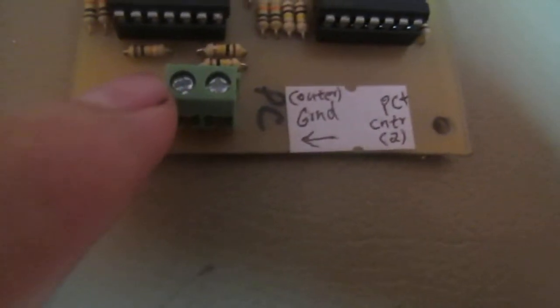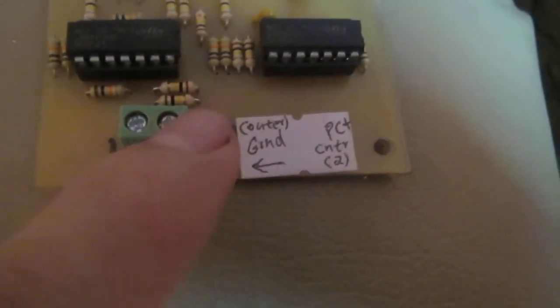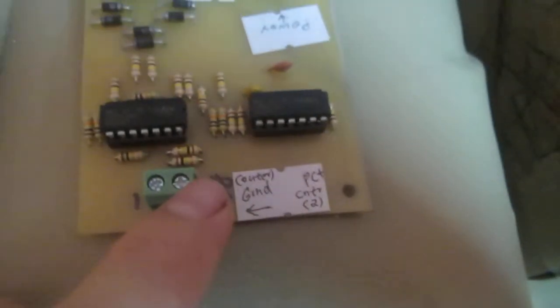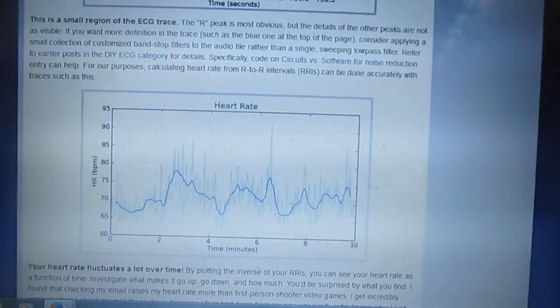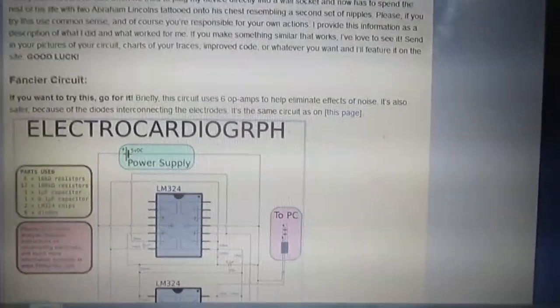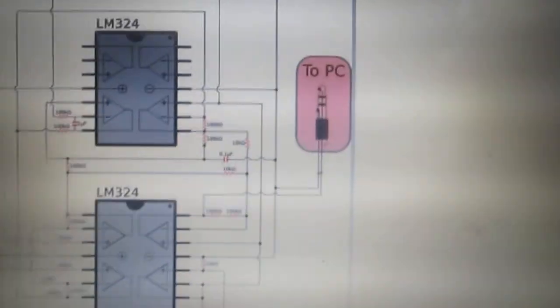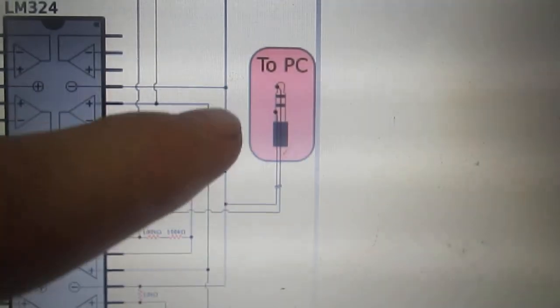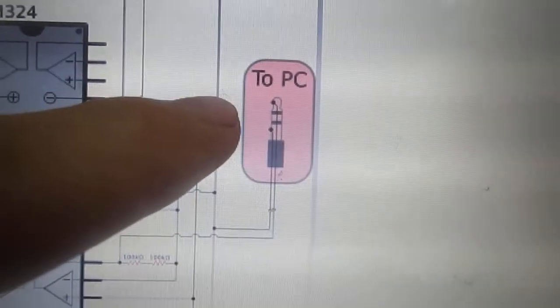This one is for ground. So, when we connect it to PC, it should be like this.